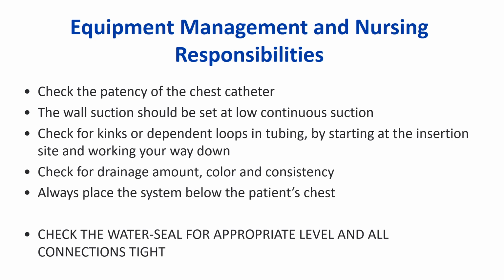At the collection unit, assess for drainage amount, color, and consistency. This unit should always be placed below the patient's chest. While looking at the unit, you need to assess for water seal and that all the connections are tight.